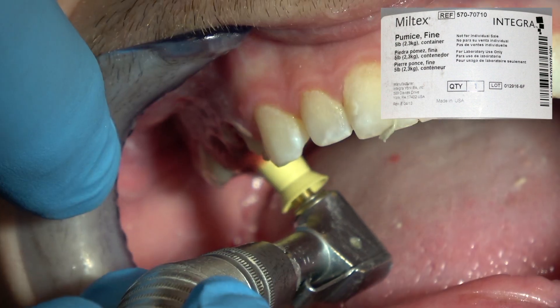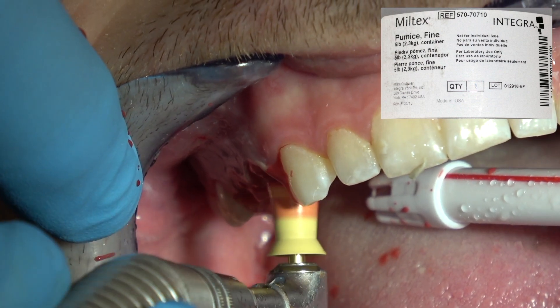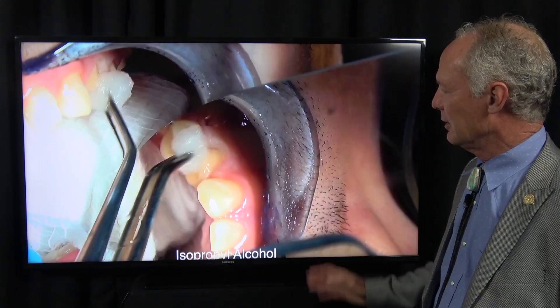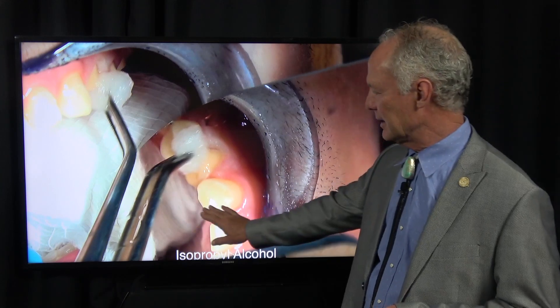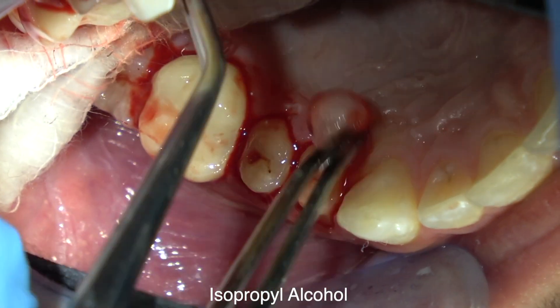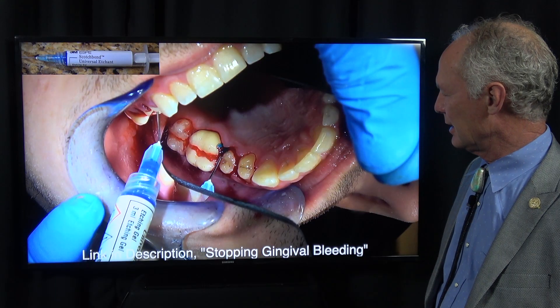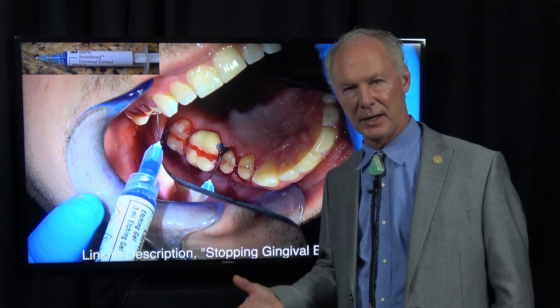The first thing I'm going to do is polish with pumice and water. You can see he's just bleeding like a stuck pig because he's not a good home care person and he's been wearing the provisionals. Once I polish with pumice and water in a prophy cup, I'm going to isolate the mouth and wipe the teeth with isopropyl alcohol on a cotton ball. I'm not worried about the bleeding right now — I just want to get any debris off the teeth. I wanted to show this case so you know we face the same thing in my real dental practice, where I practice four days a week just like you do.